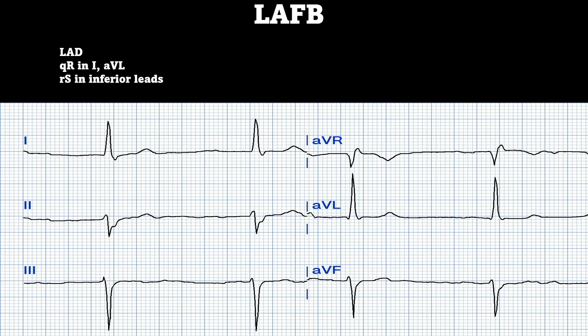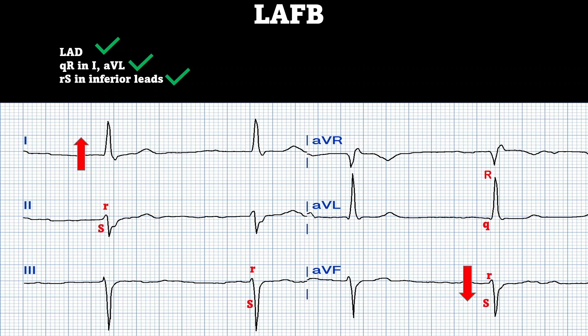Here's a left anterior fascicular block example with three criteria to check. First, do we have left axis deviation? Lead I is up and AVF is down — thumbs pointing away from each other — so yes, left axis deviation. Second, do we see small Q and big R waves in lead I and AVL? Yes — the Q wave is most noticeable in AVL as a small deflection before the prominent R wave. Third, do we have a small R and a big S in the inferior leads II, III, and AVF? Yes — a small upstroke followed by a dominant downward deflection. All three criteria confirmed.